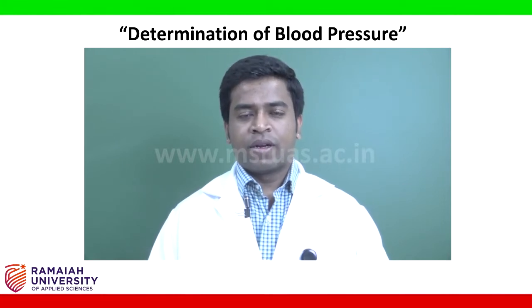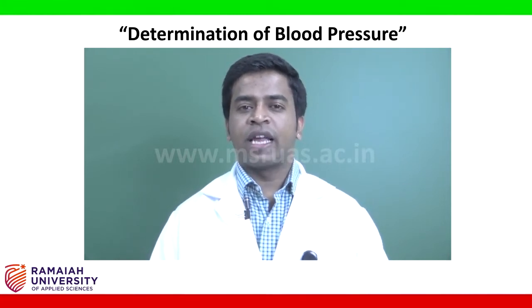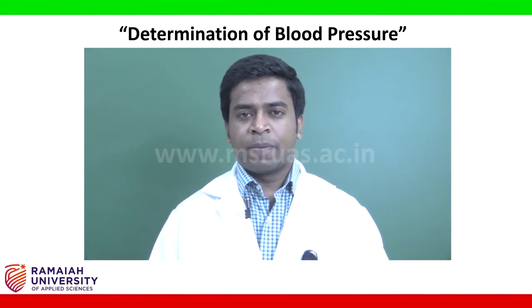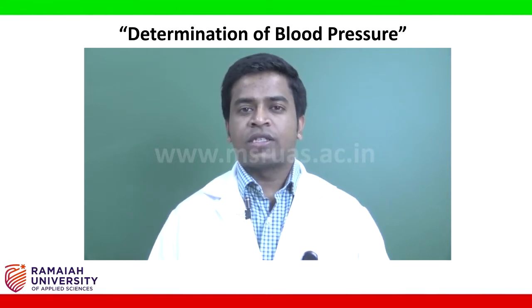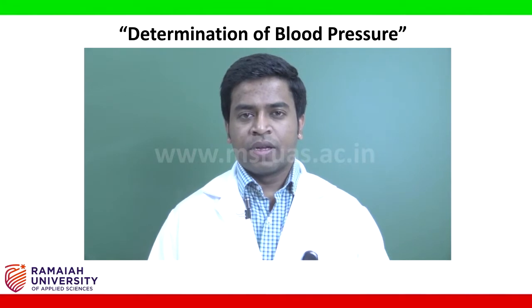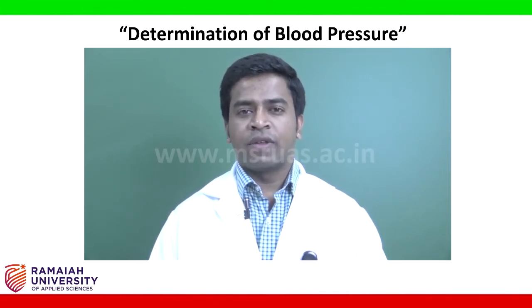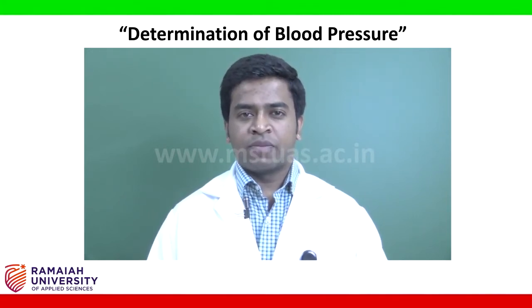Blood pressure can be defined as the pressure exerted by the blood as it passes through the blood vessels as it tries or attempts to stretch the walls of the blood vessels. Determination of blood pressure gives valuable clinical information about cardiovascular system in case of normal as well as diseased conditions. Now let us start the experiment by studying different components which are utilized in this particular experiment.